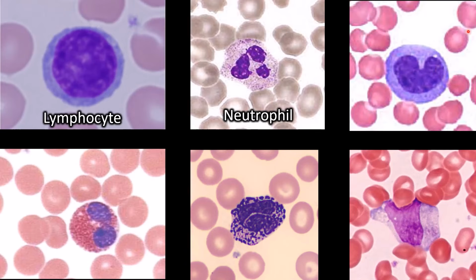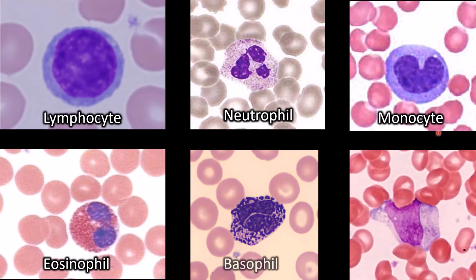This is a monocyte, and you can tell because it's quite large and it has the singular chunky kind of nucleus. On the bottom left is the eosinophil. You can tell because it is red and grainy. Next to that is the basophil because it's purple and grainy. And the last one is another monocyte.